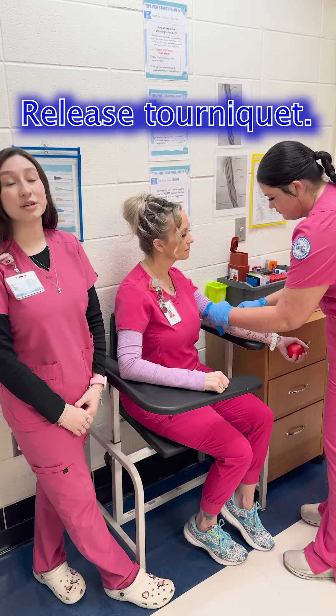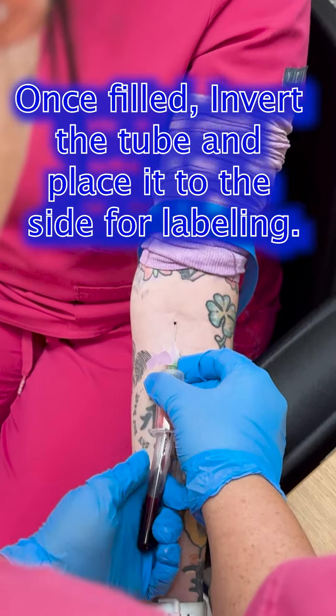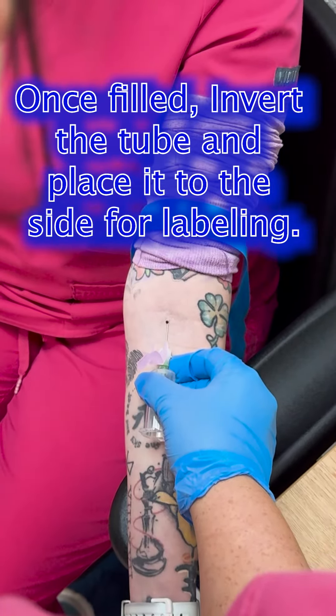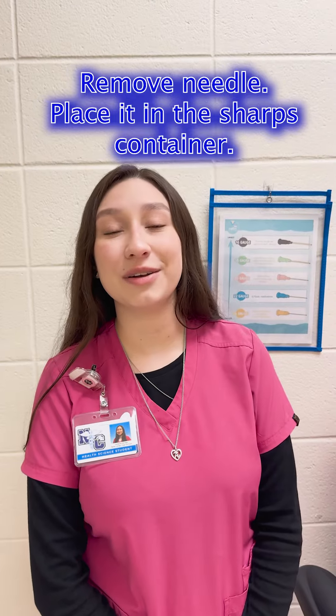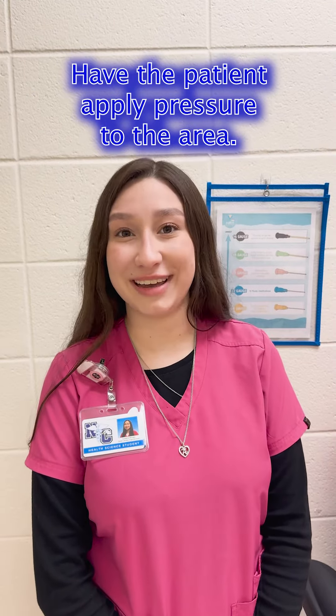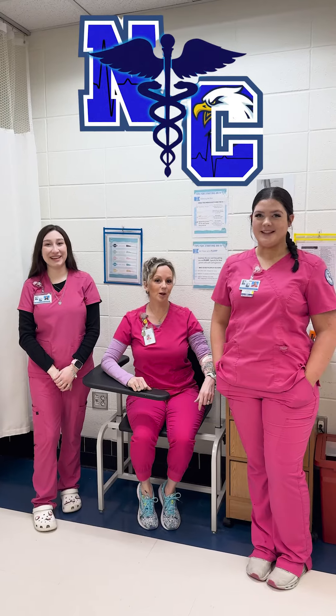Release your tourniquet kit and the tube should start to fill up with blood. Once your tube is filled, you're going to invert your tube and then place it to the side to be labeled. You're then going to remove your needle, place it into the sharps container, and have your patient apply pressure to the area. The phlebotomist is going to go ahead and apply a band-aid. And that's how you draw blood.